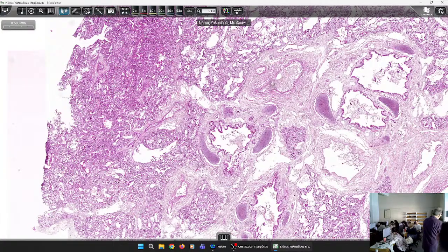So it's a particular field of interest if we have an interstitial pattern of fibrosis not related to the cases that we saw together, to make the correct identification. And I think you had a particular course on idiopathic fibrotic diseases of the lung. Isn't it so? I thought it wasn't.